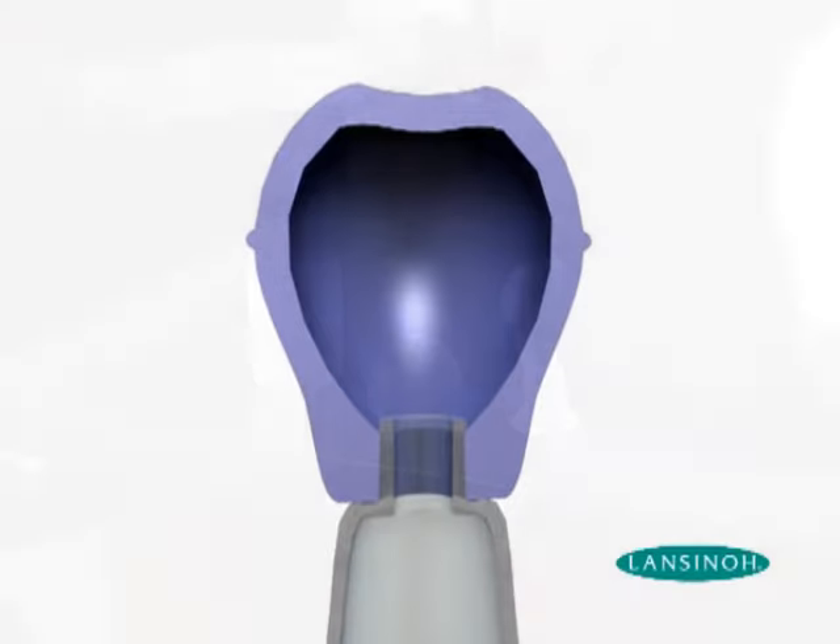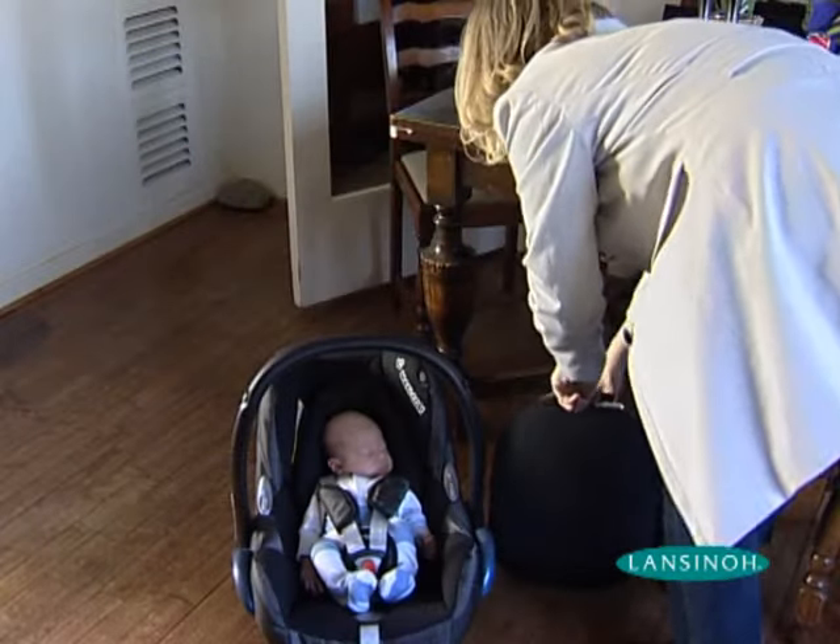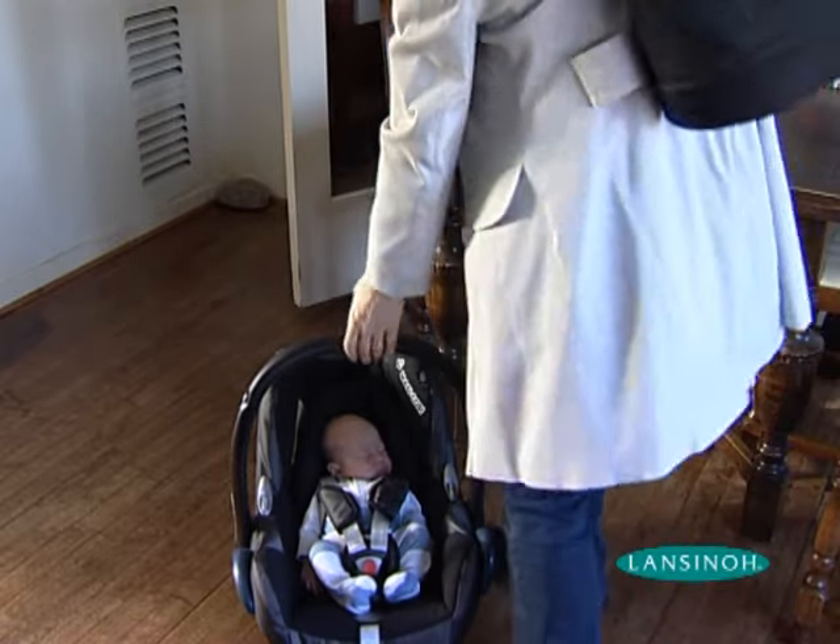The Latch Assist comes with a small case, so mum can take it with her for whenever she may need to gently evert her nipple for a better latch before breastfeeding.